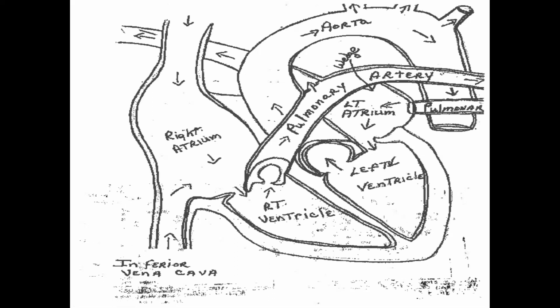If I have a Swan, or pulmonary artery catheter, it is inserted all the way into the heart, and I'm going to show you a video in a little bit, through the valve, down into the ventricle, and then it goes up into the pulmonary artery and just sort of floats around here. So the pulmonary artery catheter goes through the right atrium, through the right ventricle, and up into the pulmonary artery. And then we get different numbers once we have that pulmonary artery catheter in, and I'll talk about those in a bit. We don't really do any direct measurement of the left side.